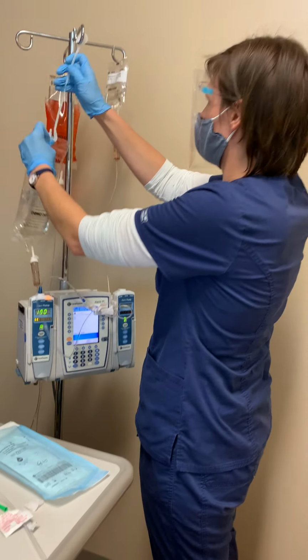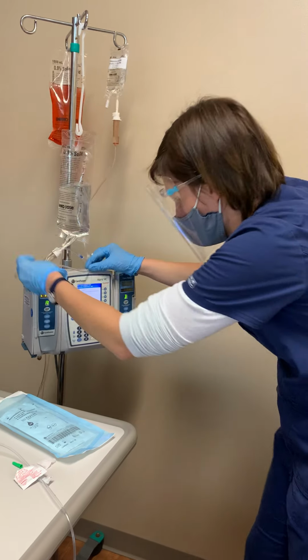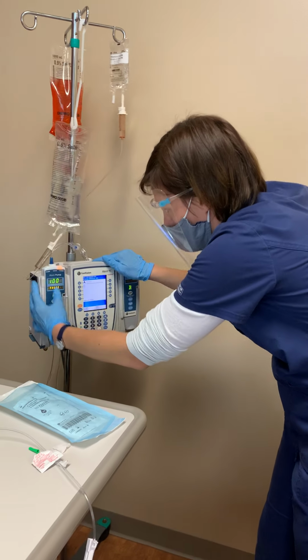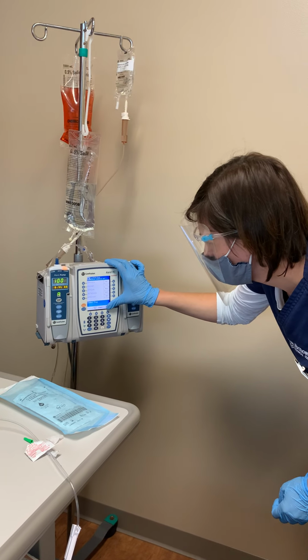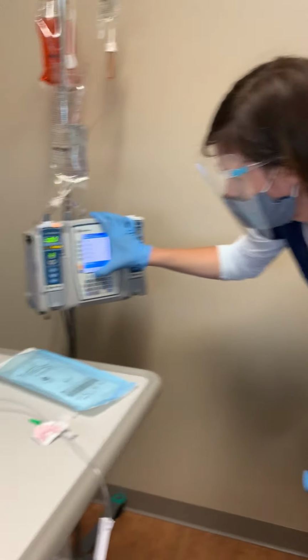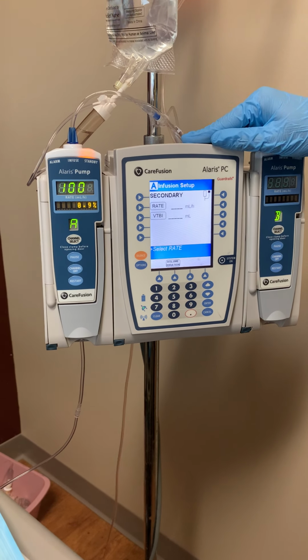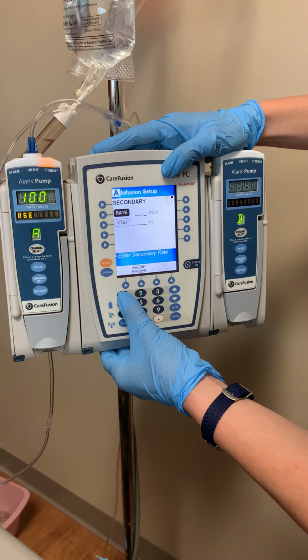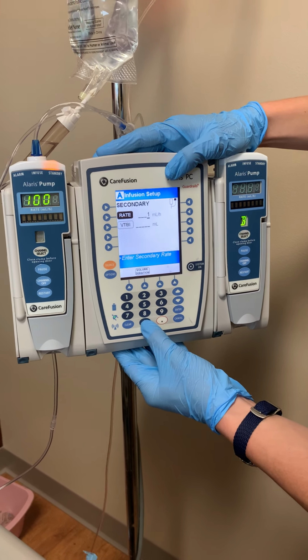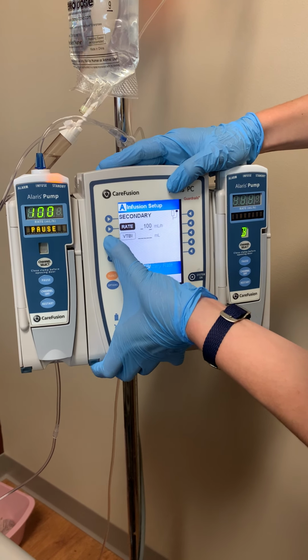I'll lower this guy. Okay, now I'm going to do the channel, secondary, and I'm going to do basic secondary because potassium is not in our Alaris pump. As previously discussed, that 10 milliequivalents in 100 ml, so I can only run it at 100 per hour.